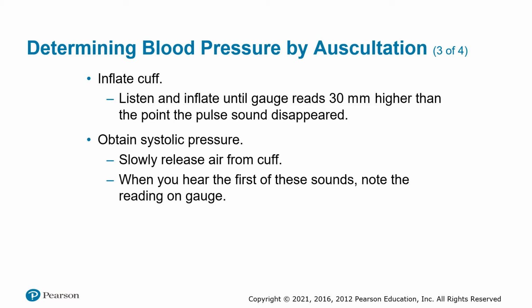There are 3 other Korotkoff sounds that you can hear. The first one in between is that the sound will go away, and then the second one is when it can come back, and then the third one is when it goes away again. So you want to make sure that you listen for definite sounds when it goes away.